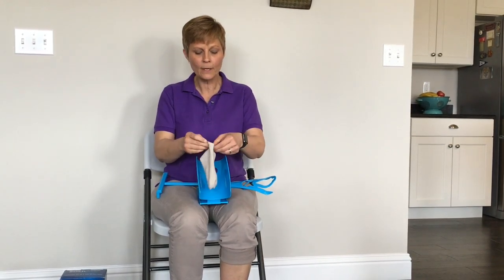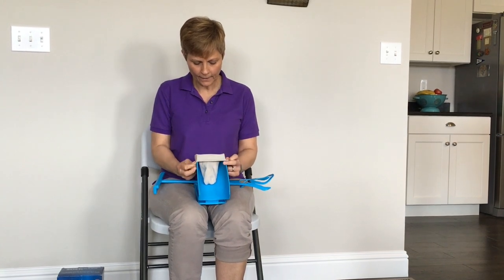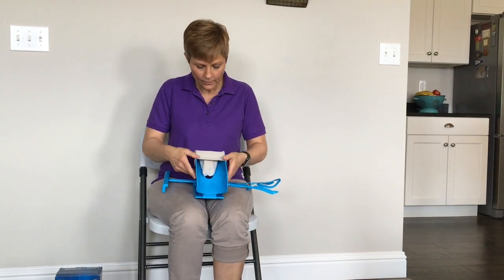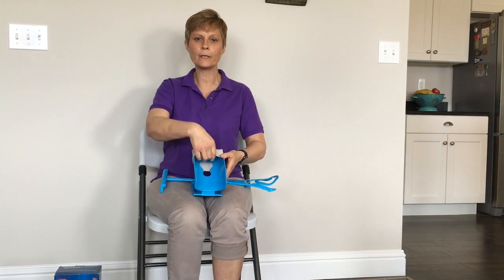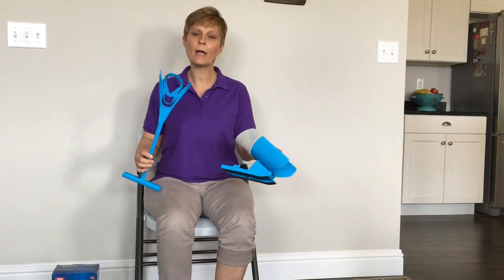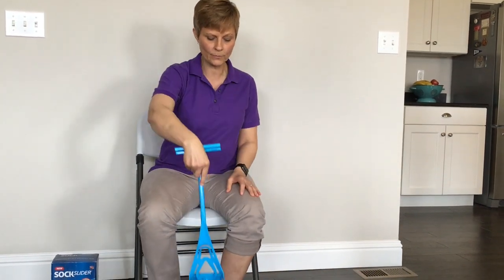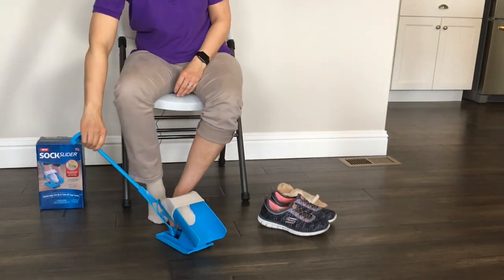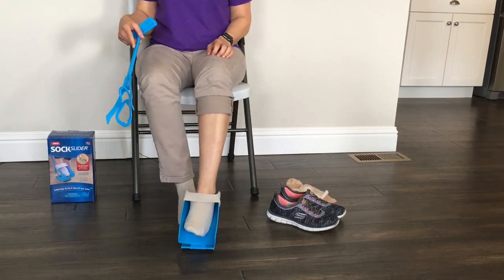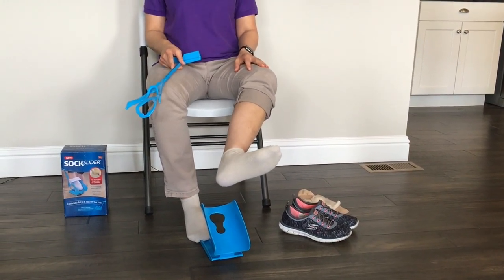So this is an athletic sock. What you do is you point the toes away from you. You're going to open the mouth of the sock and slide it over the end of the Sock Slider. I've practiced this several times — I'm trying to get the heel pretty close to this cutout right here so that the heel ends up where it's supposed to whenever I put it on. If you have difficulty bending over, you can use this little piece — you can hook it right here on the back hook and lower it to the floor for yourself just like this. I'm going to slide my foot in and push through, and there we have it — my sock is on my foot. So that's for the athletic sock.